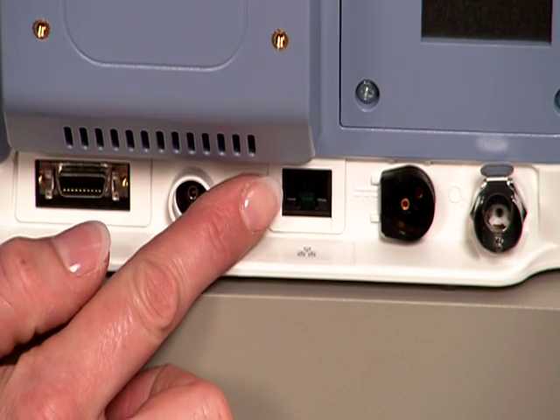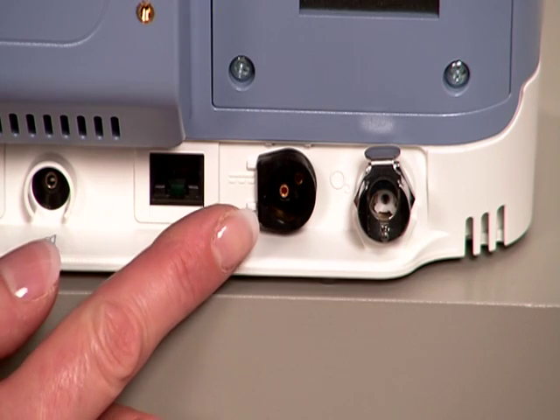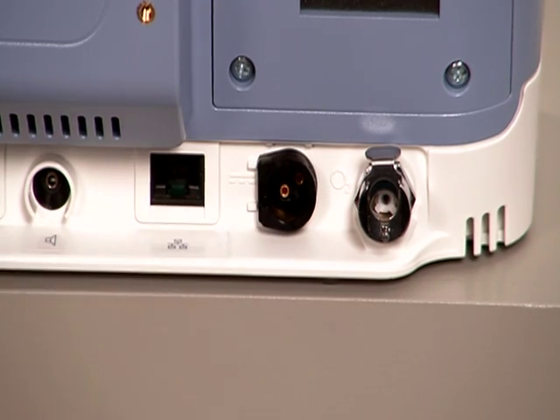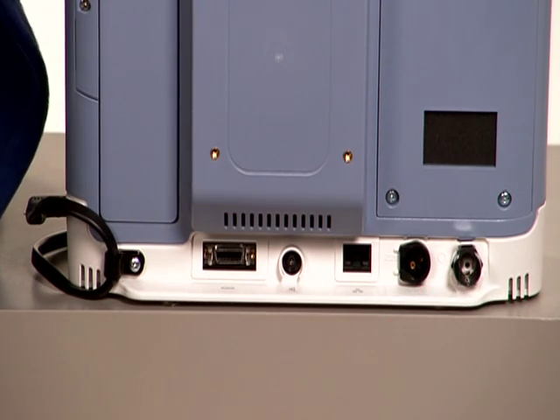Your home care provider may connect a PC to your device and upload information about your therapy using an Ethernet connector when available. An external battery connector lets you hook up an external standalone lead-acid battery to Trilogy100 using a Trilogy100 DC battery cable. And finally, an oxygen valve port is available for patients who require supplemental oxygen.